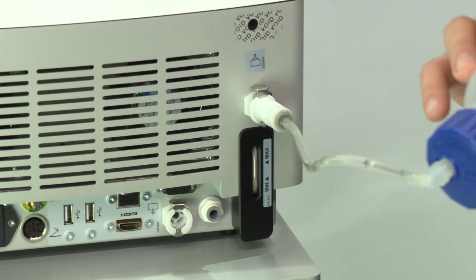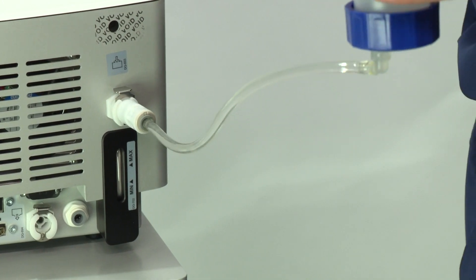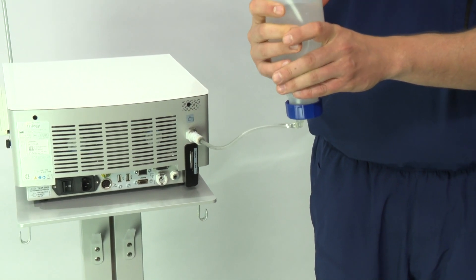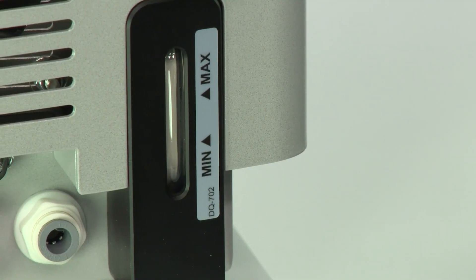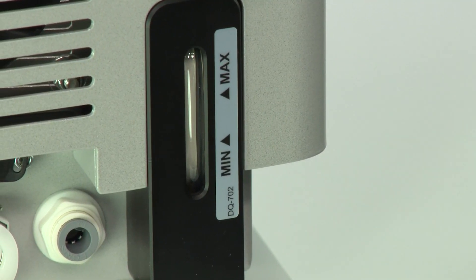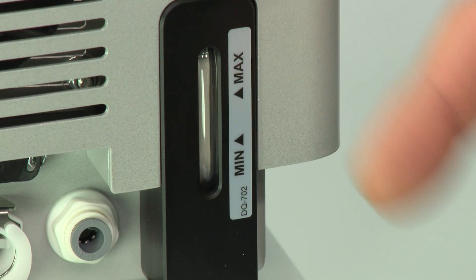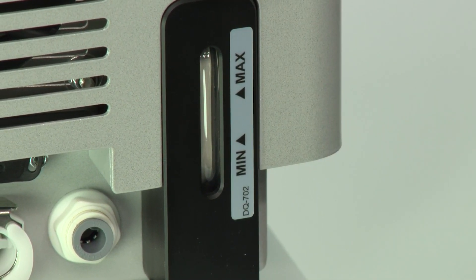Invert the filling bottle and squeeze it to fill the tank. Make sure that the level of water in the tank is between the minimum and maximum indicators. If you accidentally overfill, refer to the empty cooling liquid circuit video.